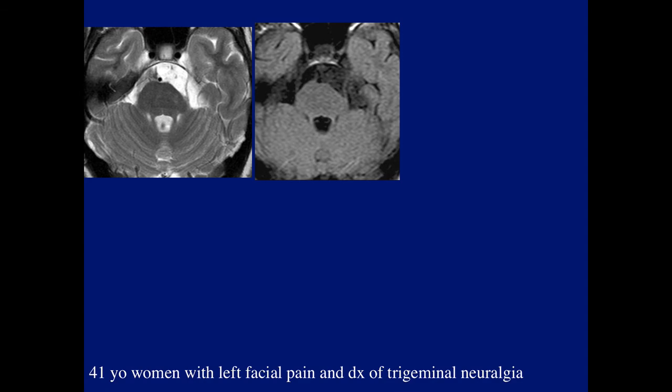Right or left? Correct. Notice here's the right trigeminal. This left trigeminal looks very atrophic. Then we have this, which is not CSF. What is this peculiar density? I presume you want more images, which I'm happy to oblige.